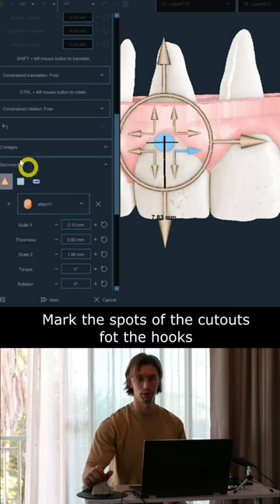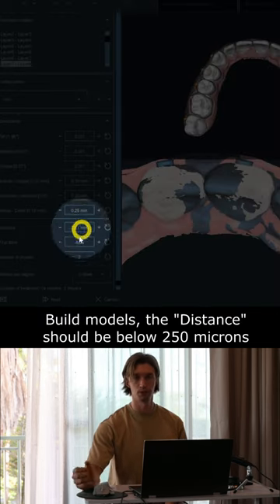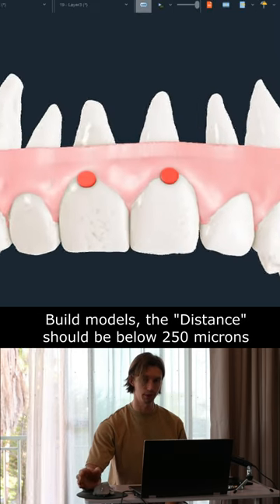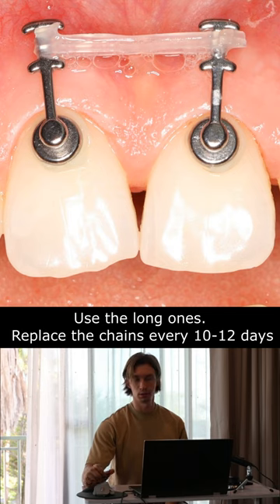Then mark the places where we're going to bond the hooks, build the models keeping the distance below 250 microns, and bond the long hooks as shown in the picture.